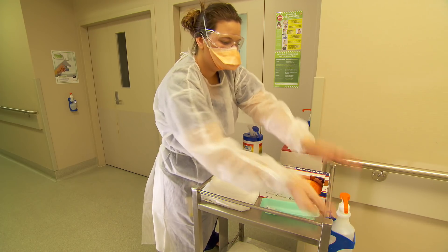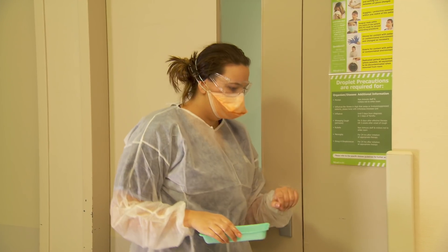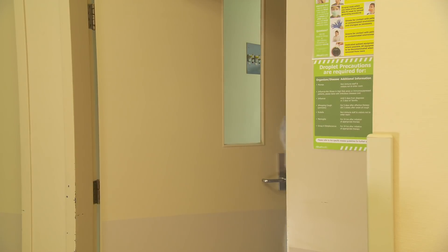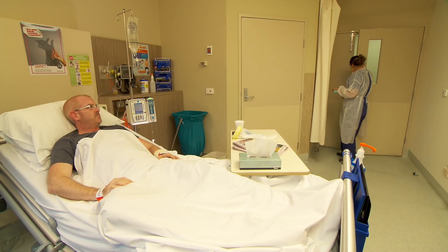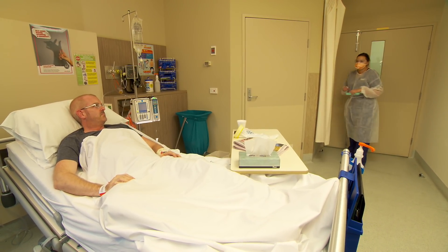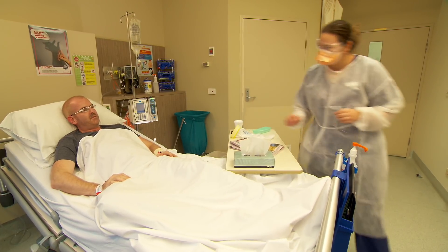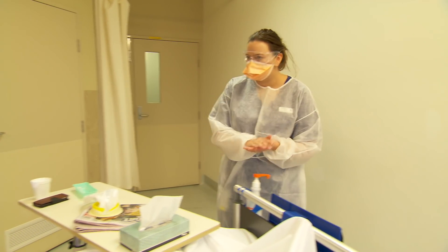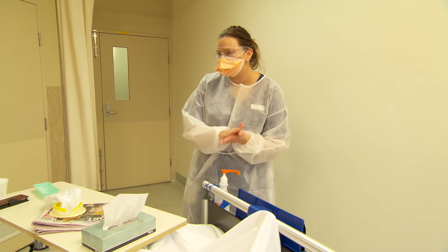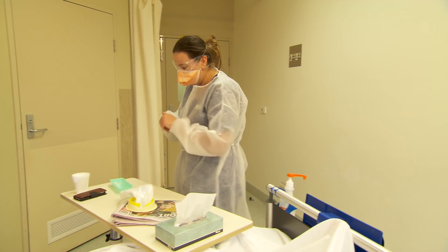Protective eyewear is required to be worn by Tenille as she will be within one metre of John. Hand hygiene is performed, and using a non-touch technique you can now enter the patient's room. Once inside the patient's room, hand hygiene is performed again.